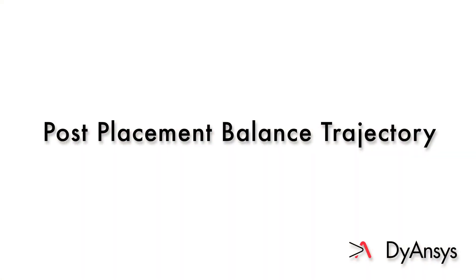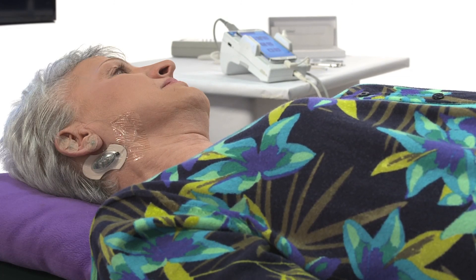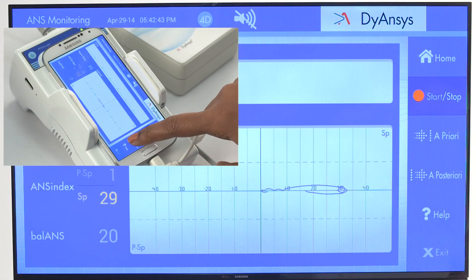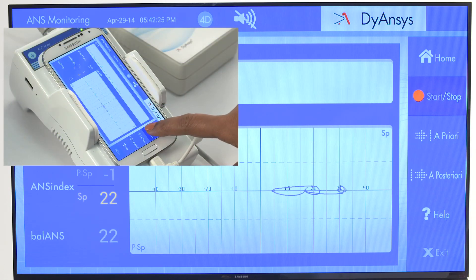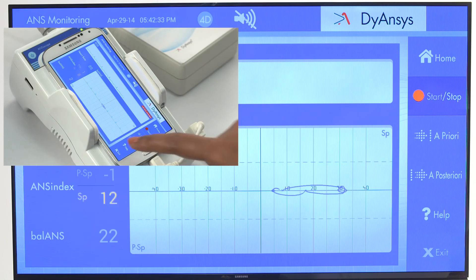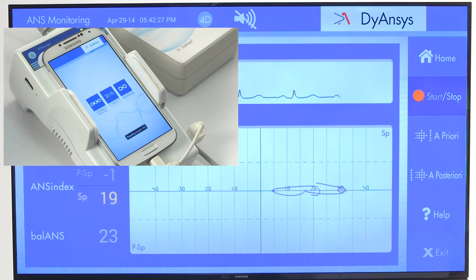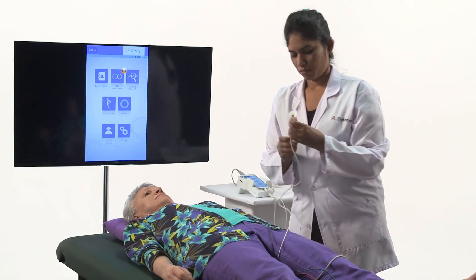Post-Placement Balance Trajectory. Leave the patient in position with the needles in place for a few minutes. Select A posteriori to save the balance trajectory after ANSYSTEM treatment. Press the stop button to end the measurement. Select exit to return to the ANS measurement sub-screen. The trajectory will reflect patient improvement over the full course of PSTEM treatment as it moves towards the parasympathetic. Remove the electrodes and let the patient relax.